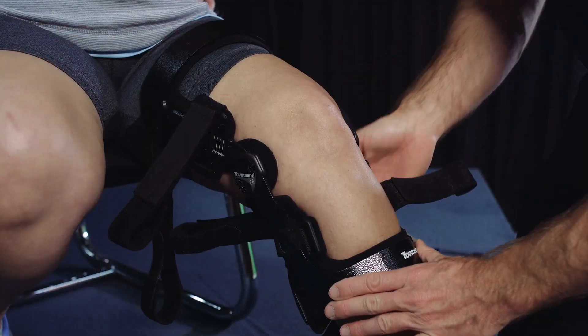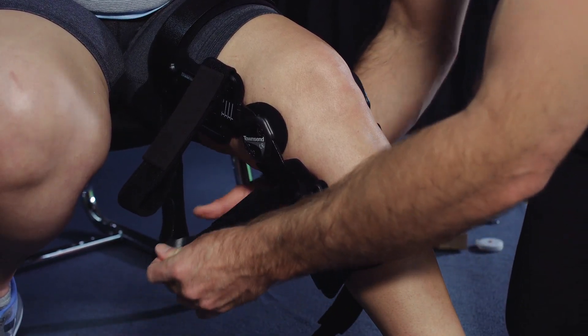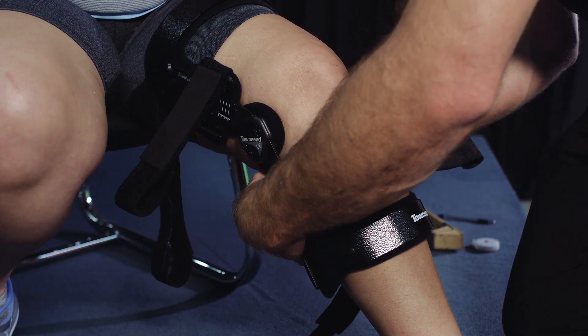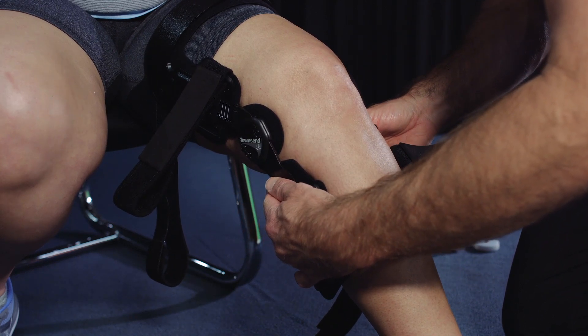Secure the synergistic suspension strap, which is the upper posterior calf strap. This strap should be positioned above the calf in the flexion fold behind the knee to utilize the calf muscle as a natural shelf to maximize suspension. Tighten the strap and secure it using the Velcro tab.